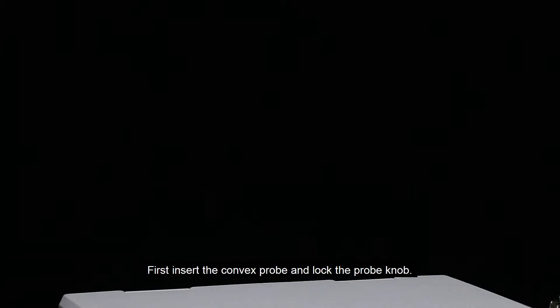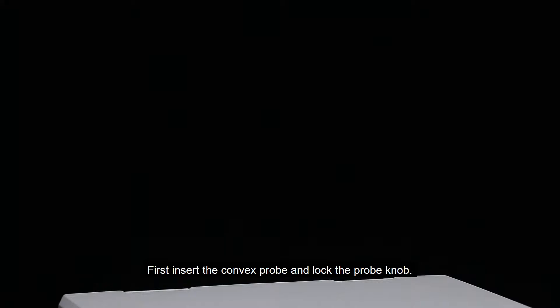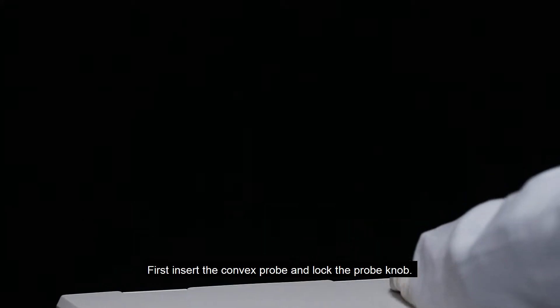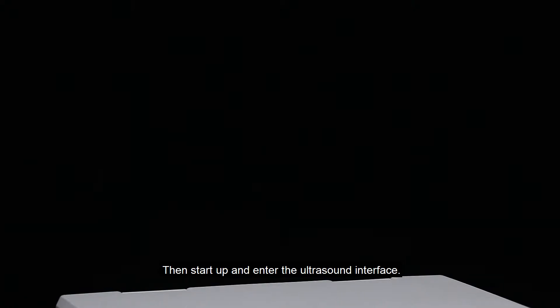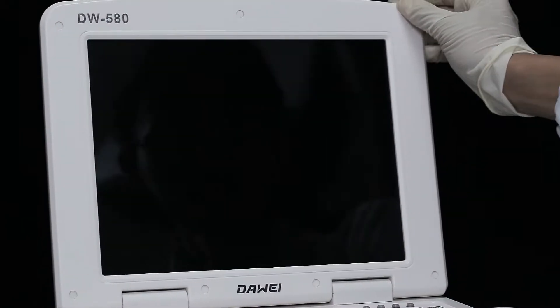Demonstrate liver, gallbladder, pancreas, spleen, and kidney examination. First, insert the convex probe and lock the probe knob. Then start up and enter the ultrasound interface.